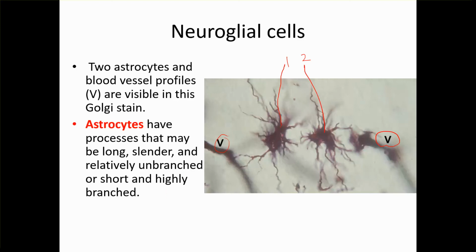So that's astrocytes. Hopefully in pathology you will also study some tumors related to these cells. If there is any tumor, it's called astrocytoma. So you should remember the word astrocytes.